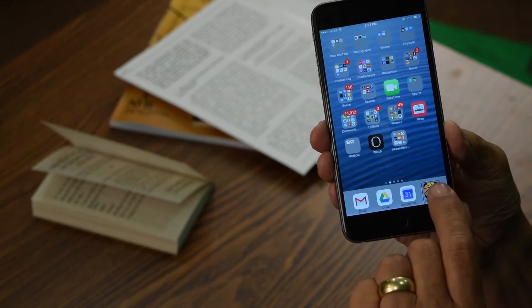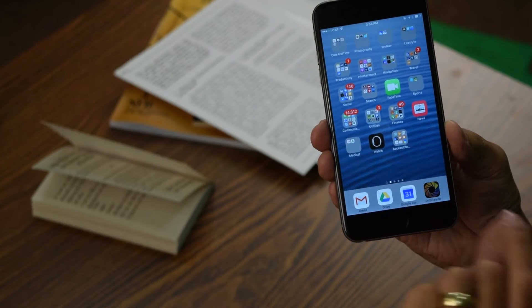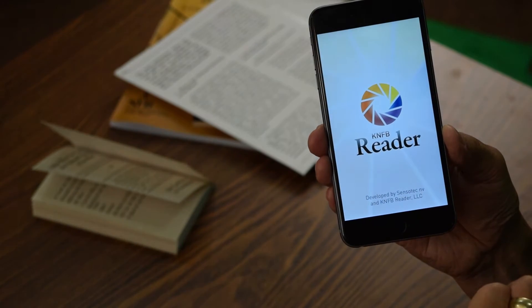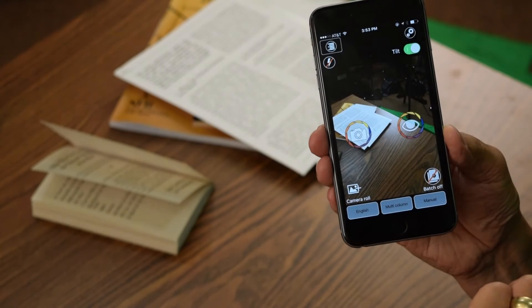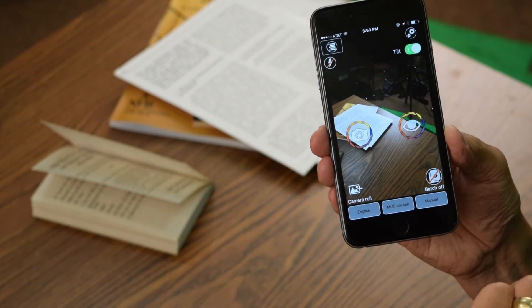First, I'm going to start the reader. KNFB Reader, take picture. And we're back at the take picture screen. That's always where we start in the reader.